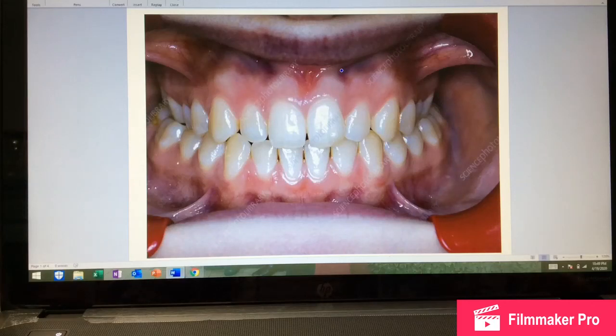This is a video for topical anesthetic placement for anesthetic injections. The first tooth we're going to do here is tooth number 9, and we need to do an infiltration, a field block, and a palatal injection. This is part of the ASA, or the anterior superior alveolar block, and the nasopalatine block as well.